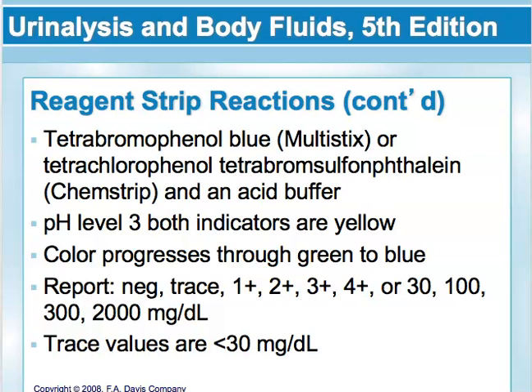As I mentioned previously, the test strips are most sensitive to albumin because albumin is capable of accepting more hydrogen ions than other proteins. So the very acidic reagent pad loses hydrogen ions the higher the protein concentration is in the urine, and the protein accepts the hydrogen ions in the reagent pad, which removes them from the pad and causes the color change.